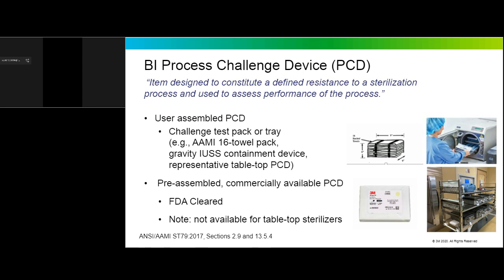For terminal sterilization in large sterilizers, like the bottom picture on the right, the recommendation is to use a pre-assembled, commercially available PCD, and that product should, of course, be FDA cleared. For tabletop sterilizers, there are not commercially available PCDs, so we'll see later that the burden then is on the end user to make their own representative PCD.